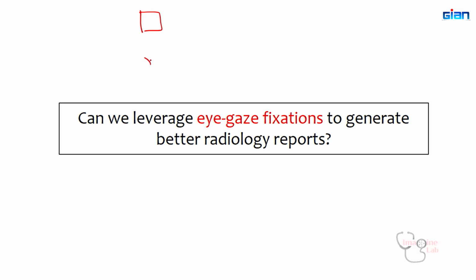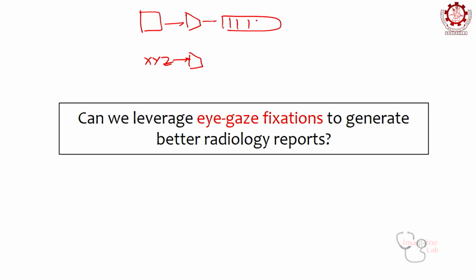Now what you can do is, you don't just have to train your deep learning or machine learning model with just images, right? You can also have a language model that you train with text data. So it's very simple. You have your images and you have your text, you have an encoder. You train your image encoder and you get your image representations. You train your text encoder and you get your text representations.